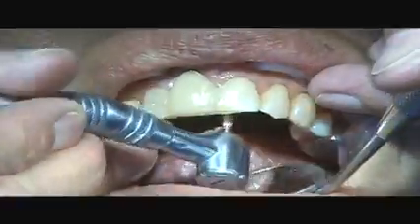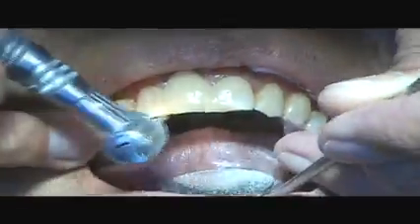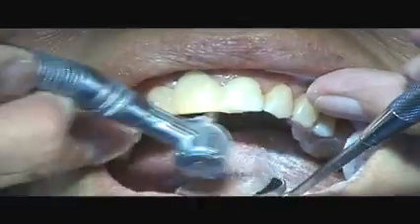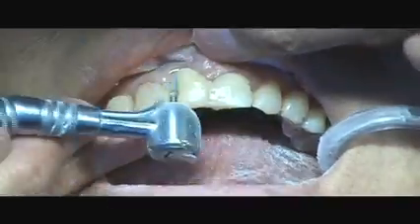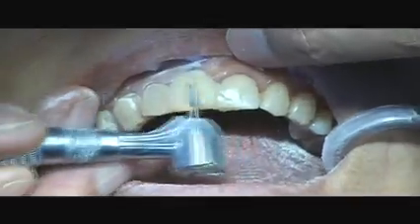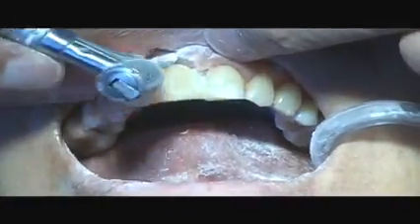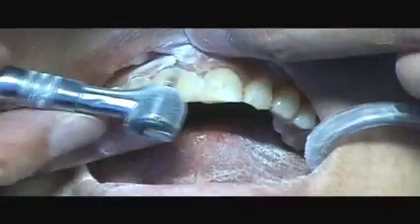Once the stent is removed, begin the lingual reduction of the composite at the gingival tooth interface. There will be a sharp, almost knife-like edge, generally, where the composite ended on the stent. First, remove this and begin thickness reduction for the patient's comfort and proper word articulation.